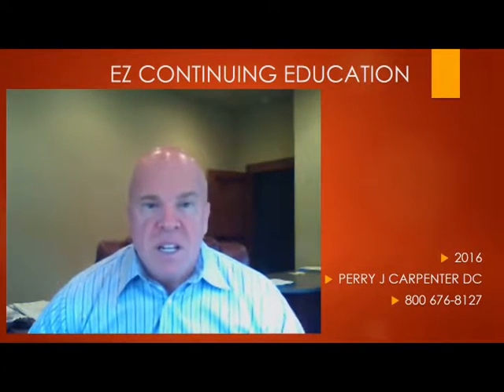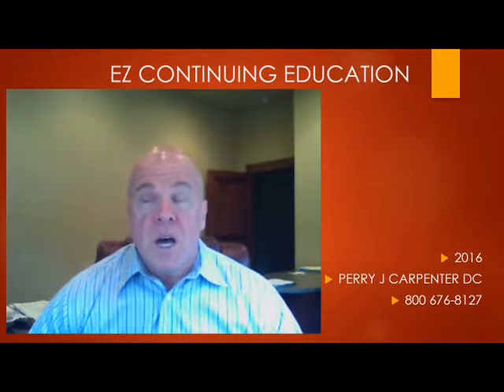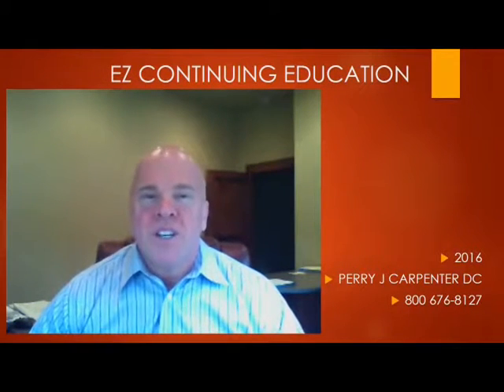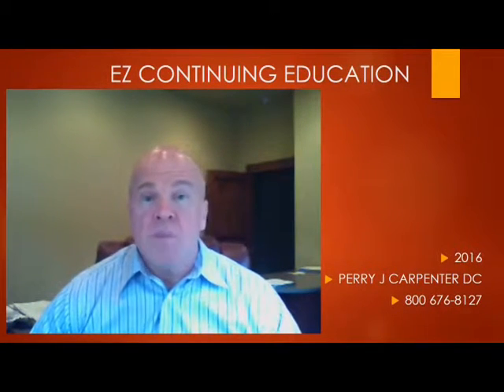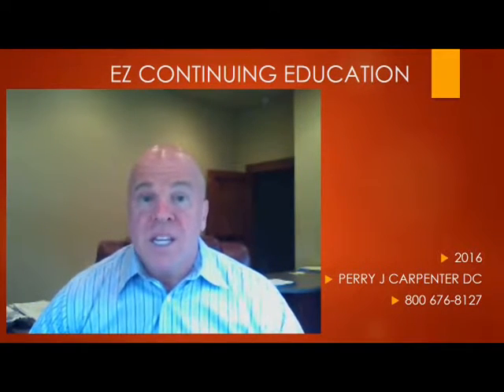And as I've stated in other video broadcasts and video discussions, obtaining the images in the first place is the major challenge that you're going to face. And after you've done this 2 to 3 to 5 to 10 times, the procedure will come exceedingly quicker and exceedingly easier.